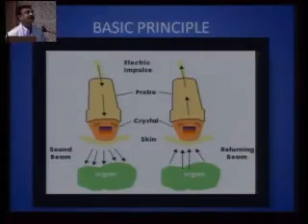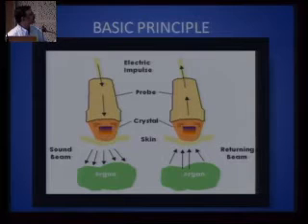So this is the basic principle of ultrasound. This is the transducer. The patient end of the transducer is lined by an array of piezoelectric crystals. And when these crystals are stimulated by an electrical impulse, they set off a sound wave which is propagated in the direction of the organ.